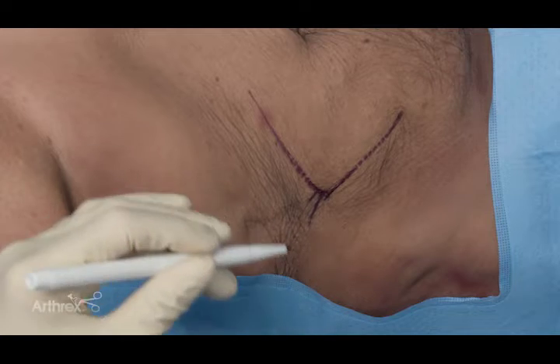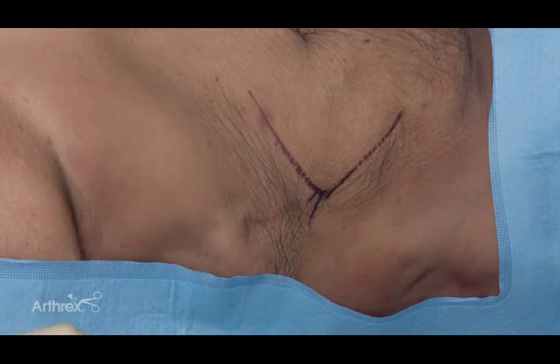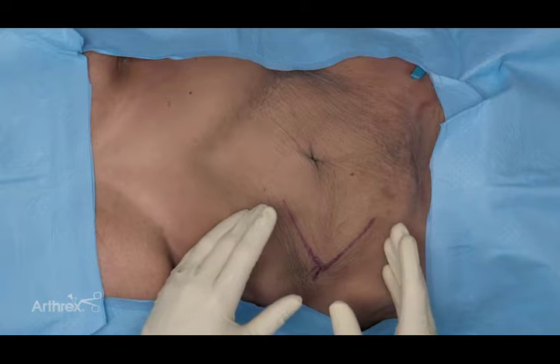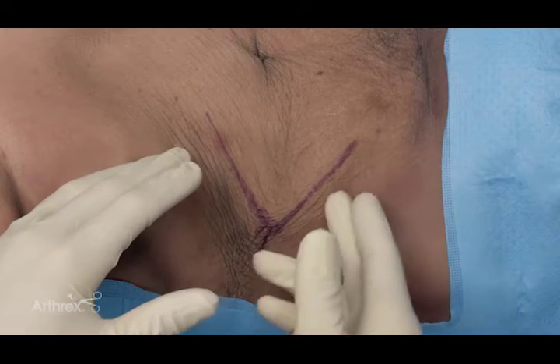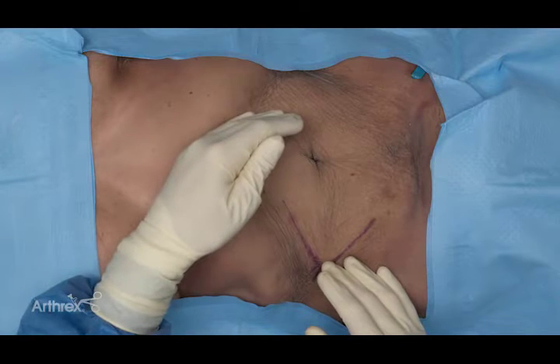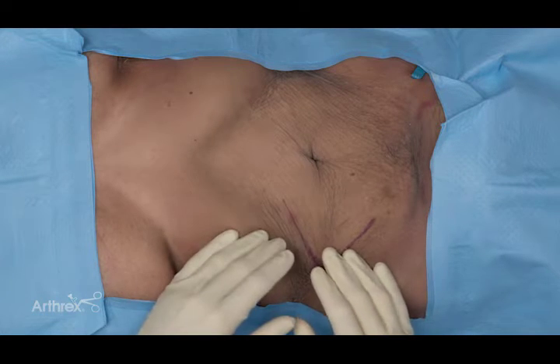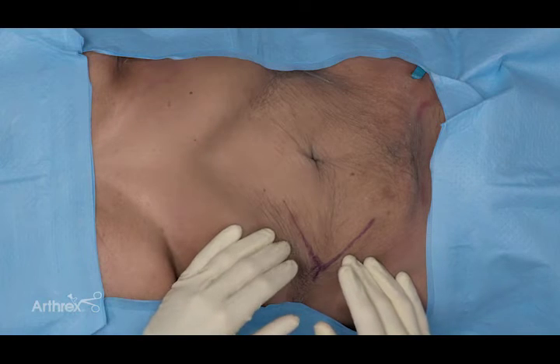Once we've marked our site, we'll do that bilaterally and prep the entire abdomen all the way across for maximum freedom. It's also important to note any surgical sites, scars, or hernias — not absolute contraindications to lipoaspirate, but areas to stay away from. Small scars are not a problem. If there's a bigger incision and none on the contralateral side, a unilateral harvest is permissible. We prefer bilateral harvest to maintain symmetry and prevent contour irregularities, but if the patient has enough adipose, harvesting away from a larger unilateral scar is the safest and most well-tolerated approach.